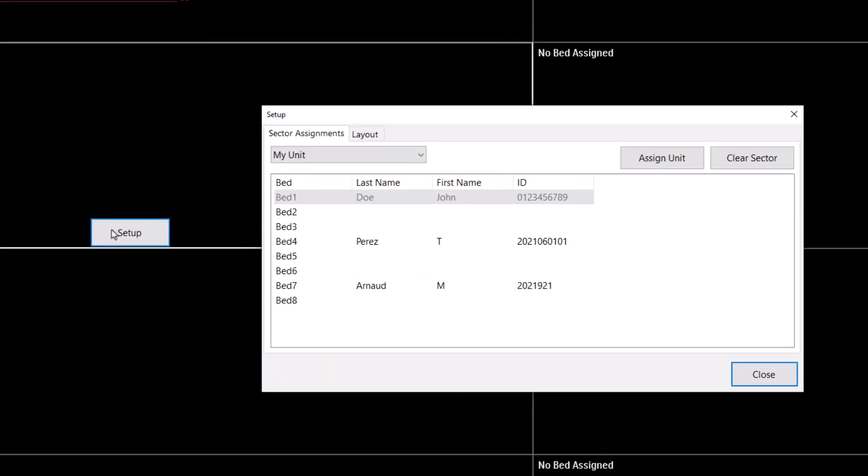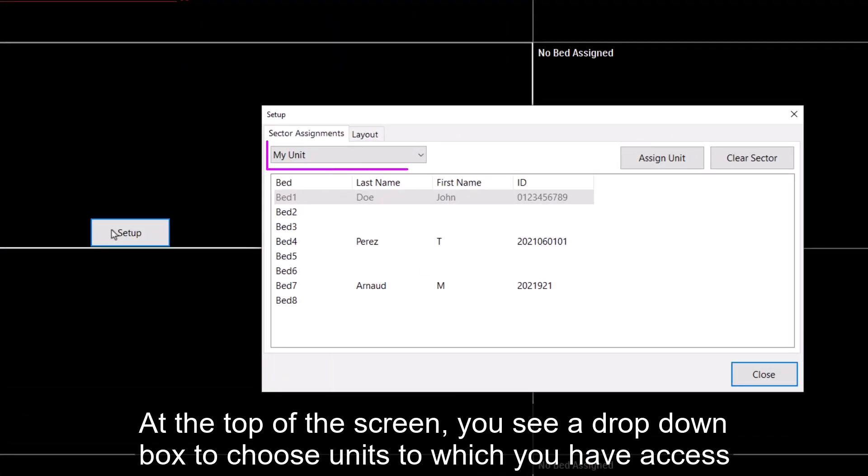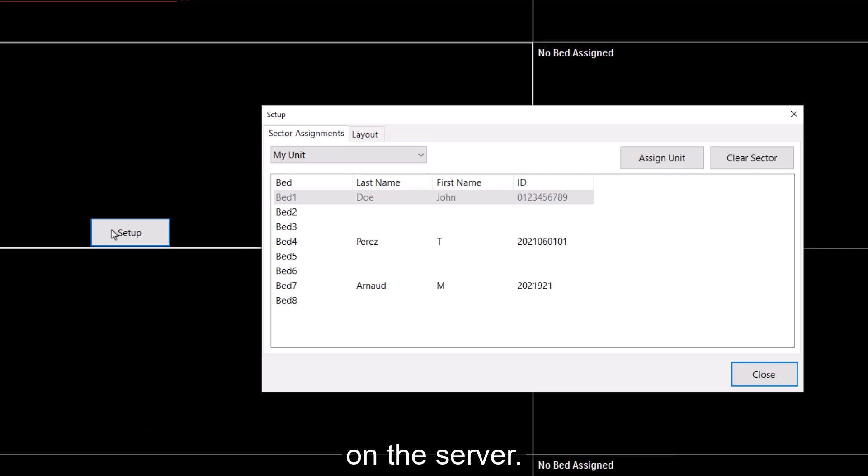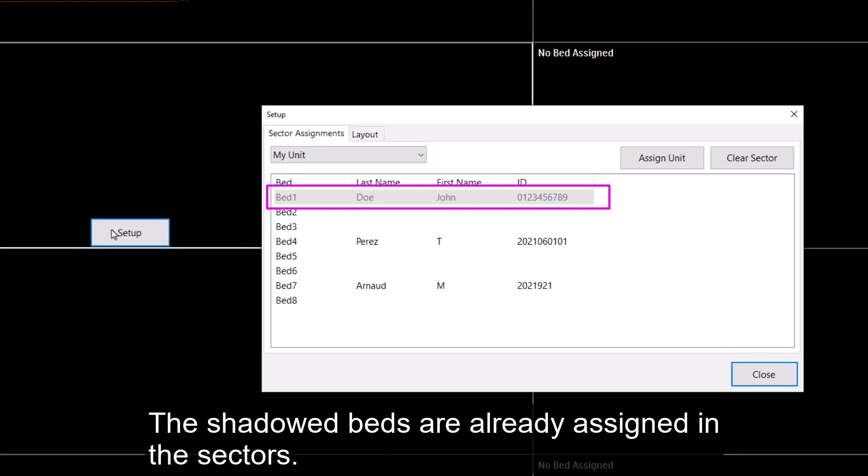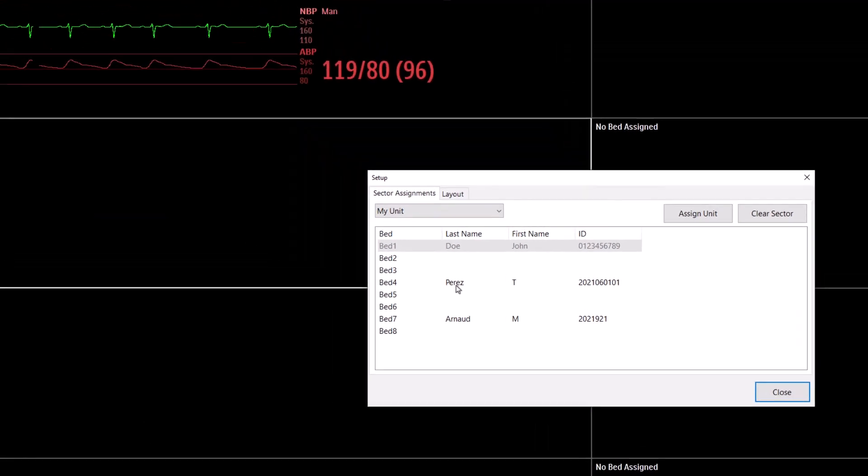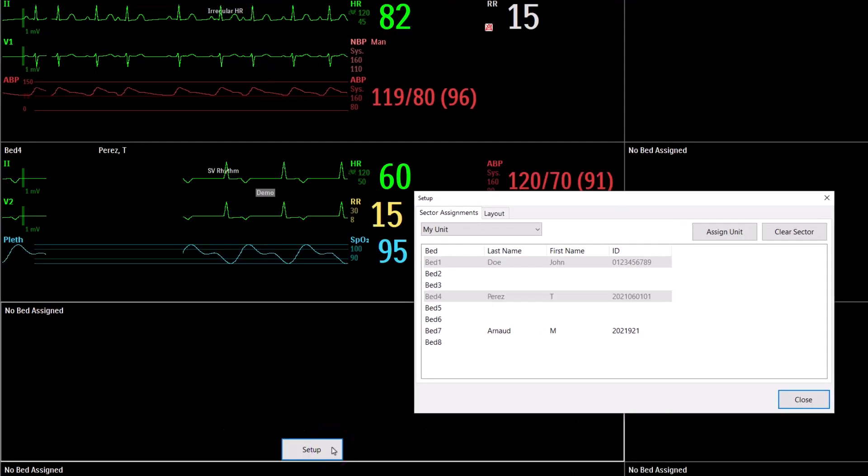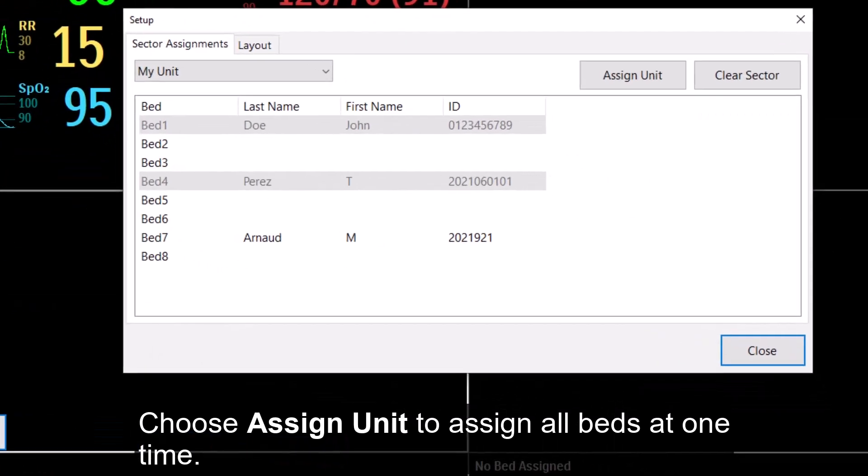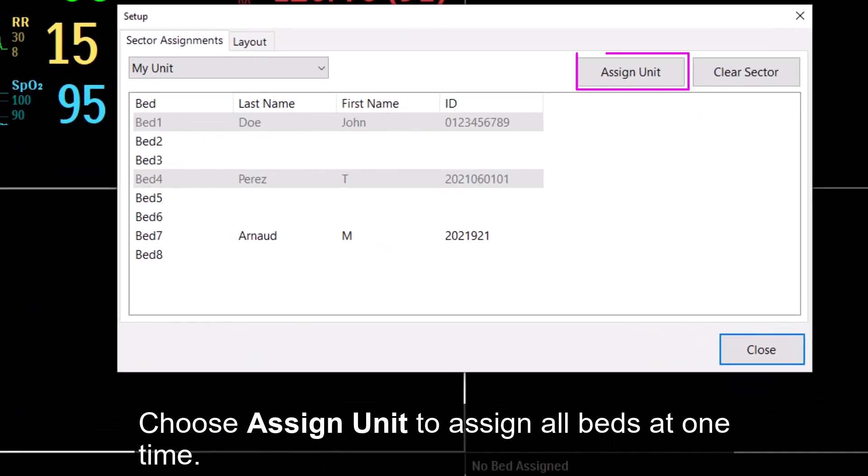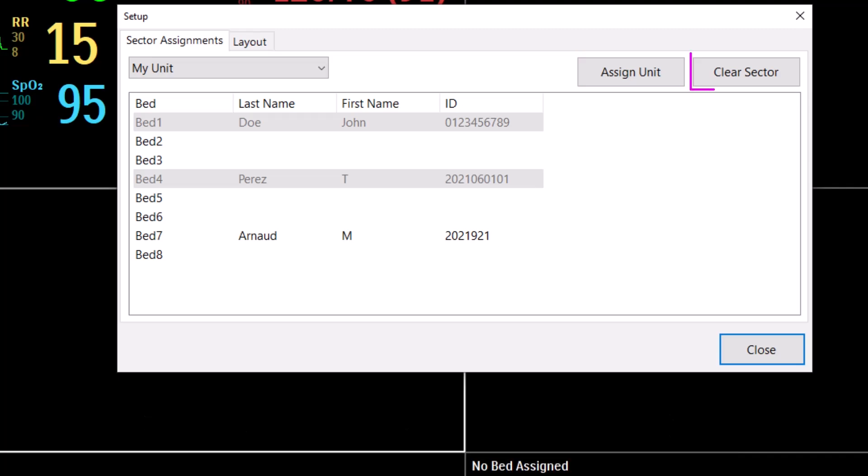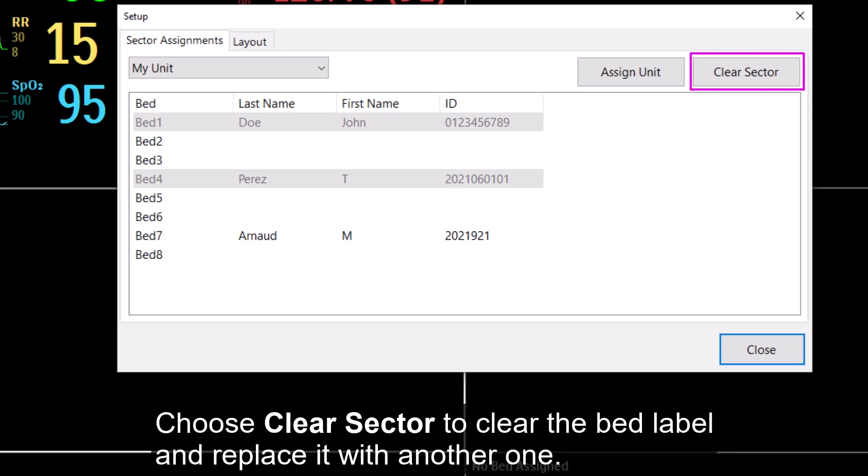At the top of the screen, you see a drop-down box to choose units to which you have access on the server. The shadowed beds are already assigned in the sectors. Choose a bed to add to the sector. Choose Assign unit to assign all beds at one time. Choose Clear sector to clear the bed label and replace it with another one.